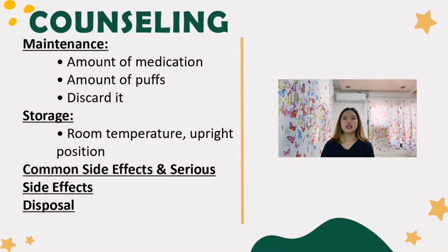Counseling is important in taking medicines, specifically in using an inhaler. First, it's maintenance. Taking note of the amount of medication remaining in your inhaler and the number of puffs is important. Even if your inhaler continues to spray after consuming all the puffs, it must be discarded. Marking a calendar is helpful to count how many days until your medication runs out. Choose 2 days prior to this date to have your prescription refilled so you don't run out. Also, it should be stored at room temperature in an upright position.